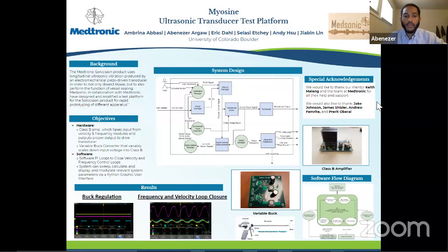And our command manager really is our central unit that puts everything together, takes in different command inputs, and outputs a lot to set this whole loop of operation. Our command manager really is our MCU. Some of the user commands that could be sent would be either allowing operation during closed loop or operations during open loop.